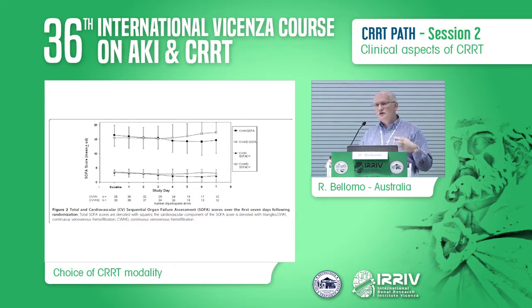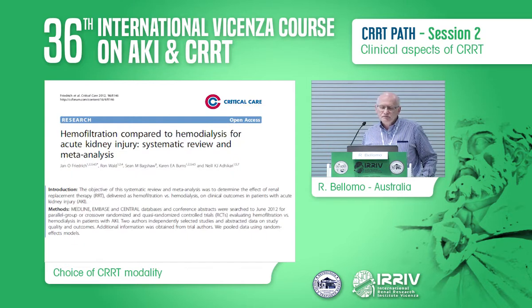Within the limitations of a small phase 2 study, there was really no significant signal there in favor of one modality versus the other, which has some utility for clinicians because it suggests that convective therapy at a clinical level is not that much better or not that much more valuable than diffusive therapy.